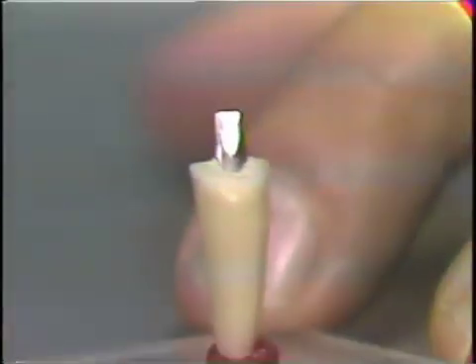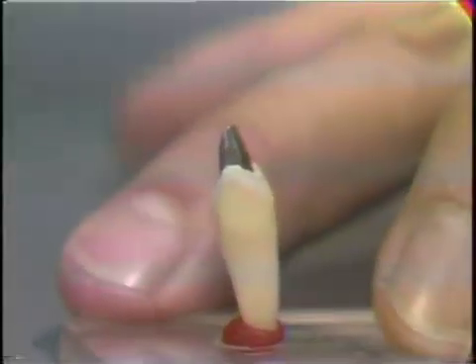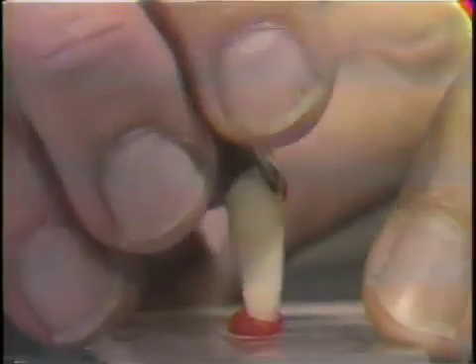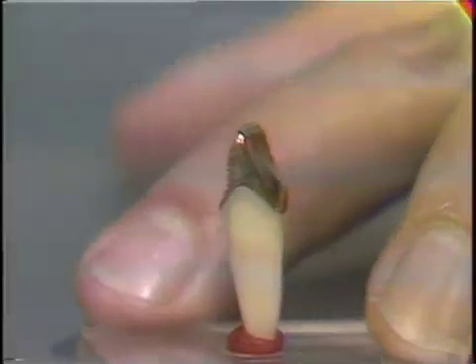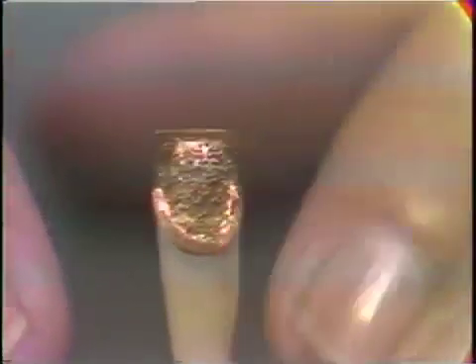The gold fabrication which is made for this, you see here an approximal view, coming around now to a labial view. Here is the window with the bead retention in it for acrylic resin in this particular case.